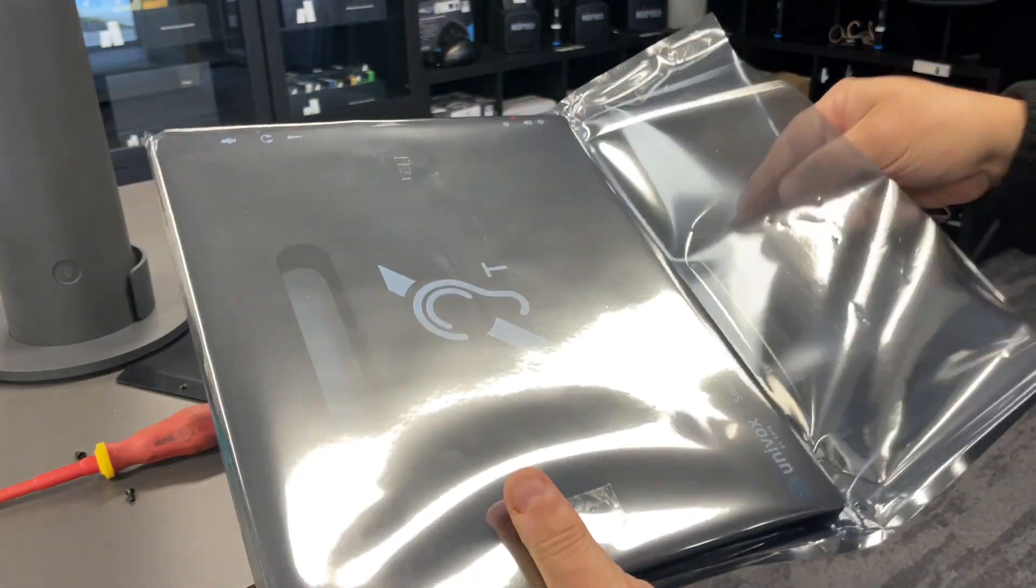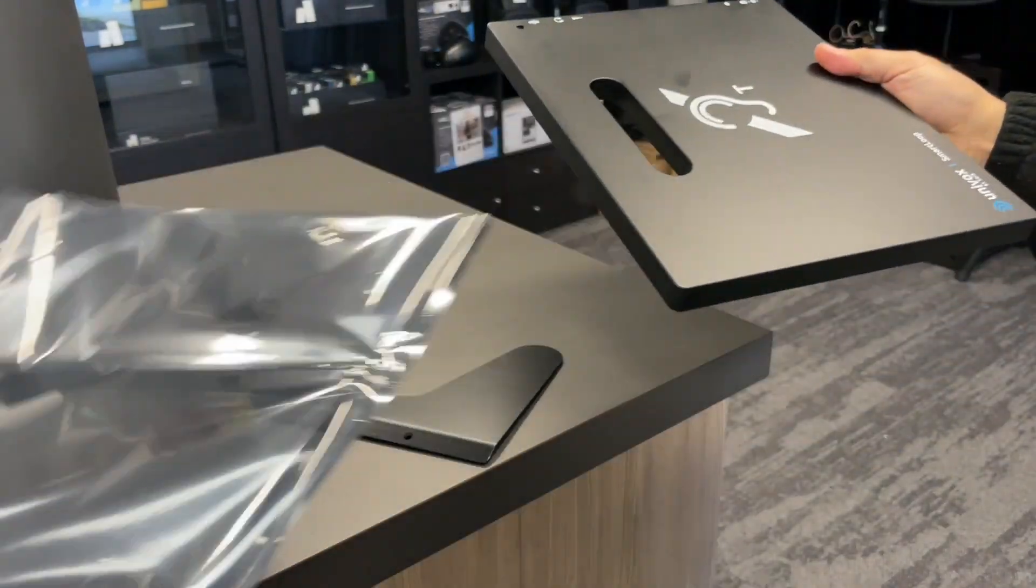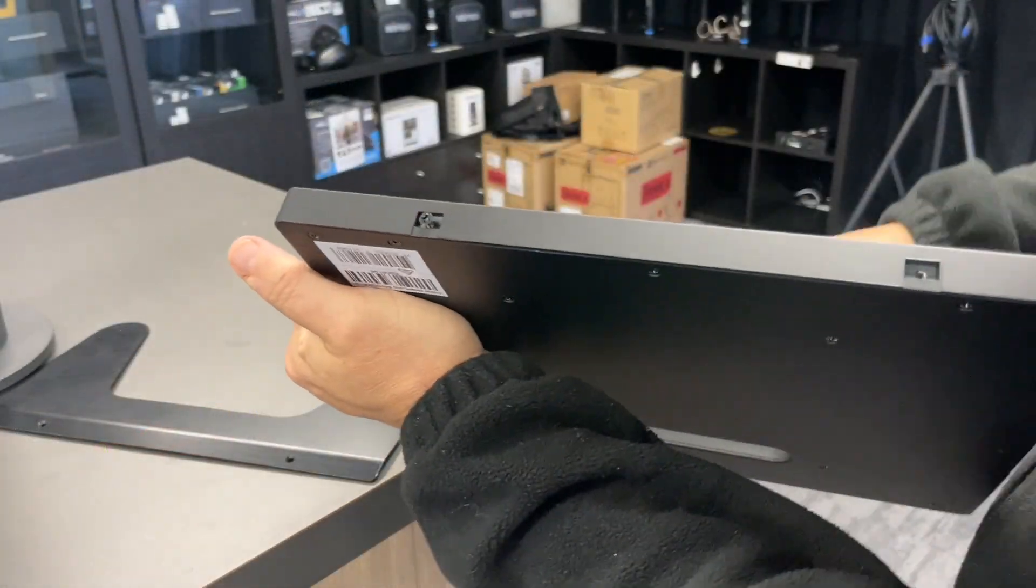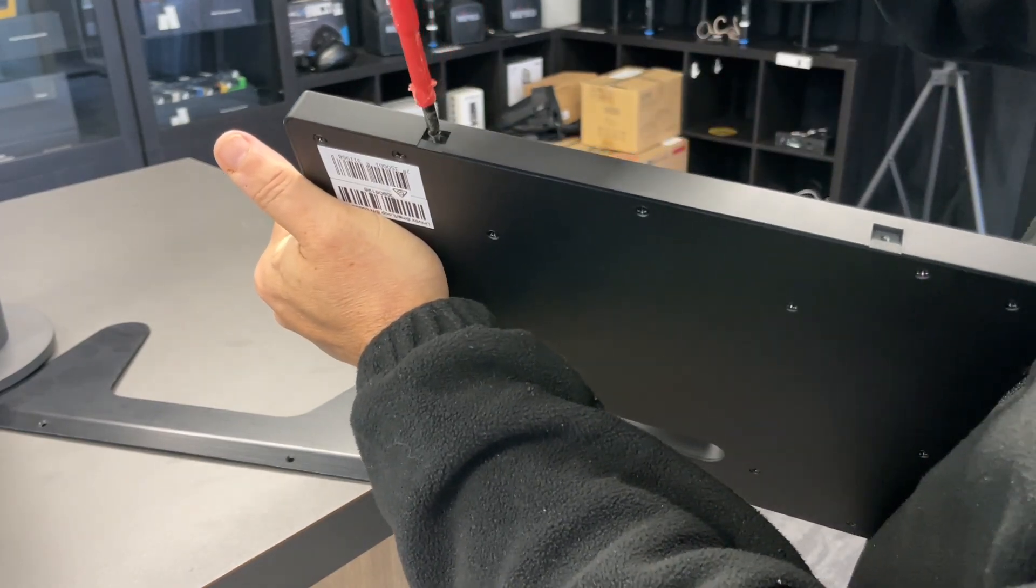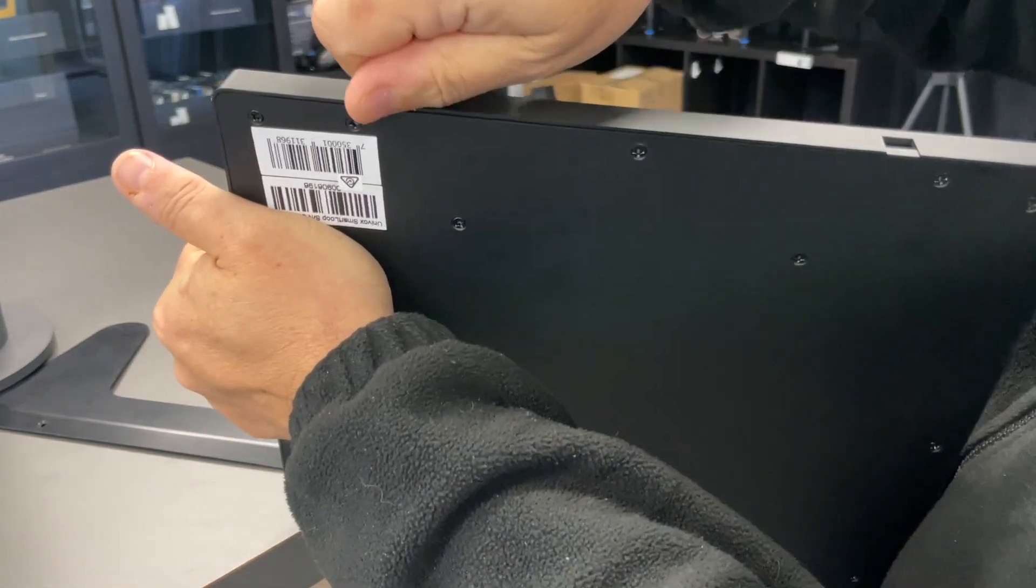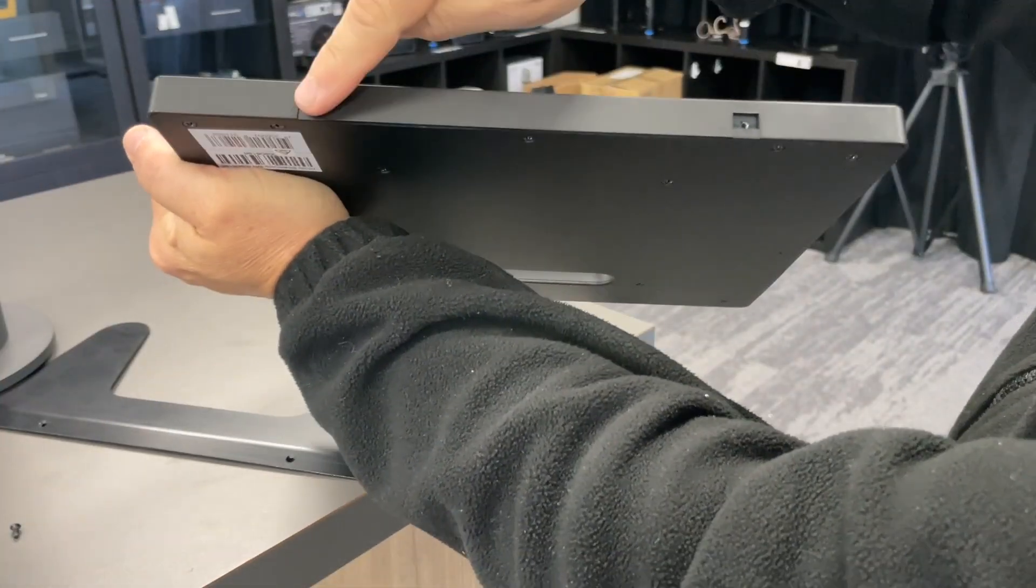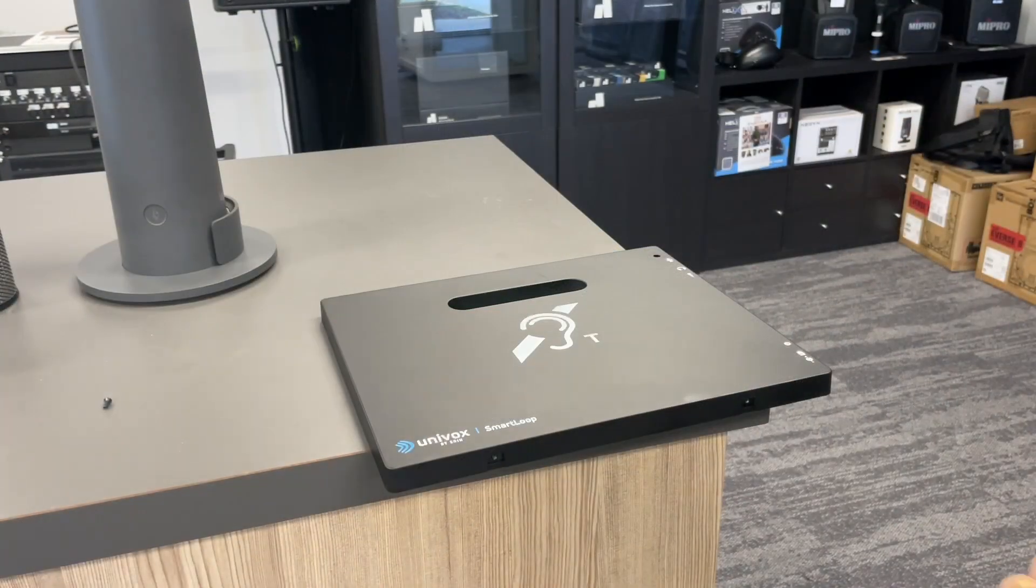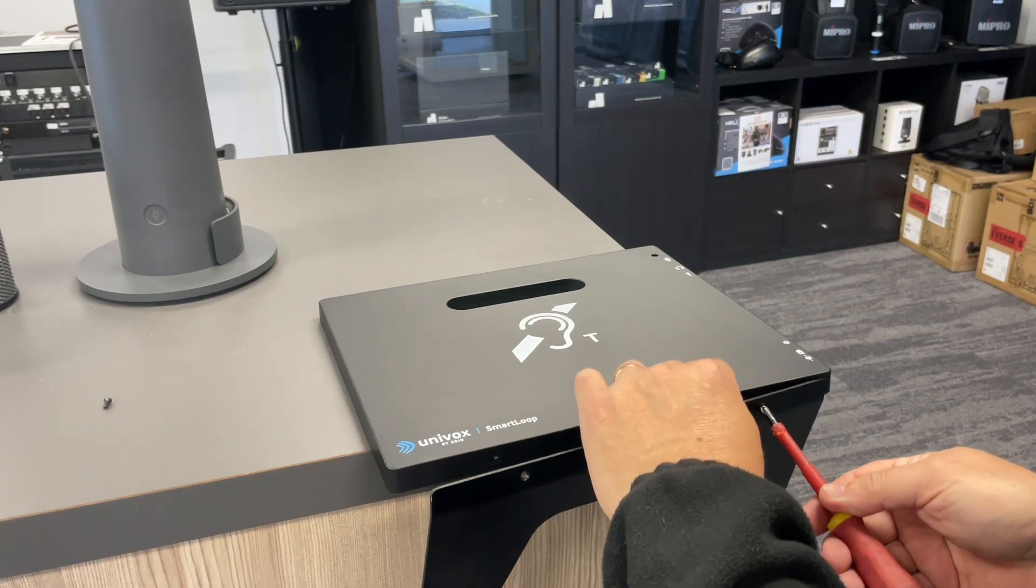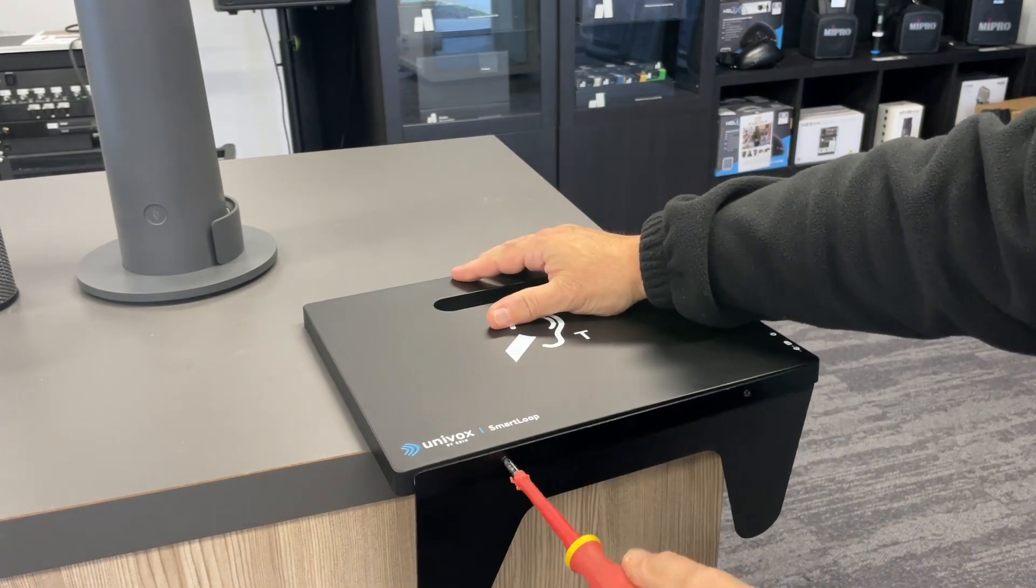Remove the unit from the packaging. Undo the two base mounting screws, remove them, and mount the base mounting plate to the unit. Mount both screws back.